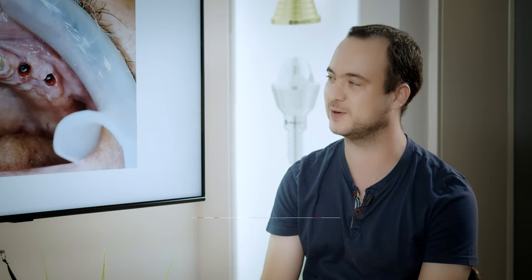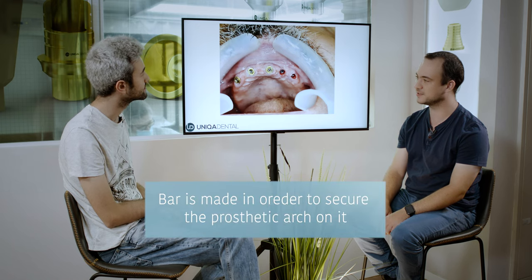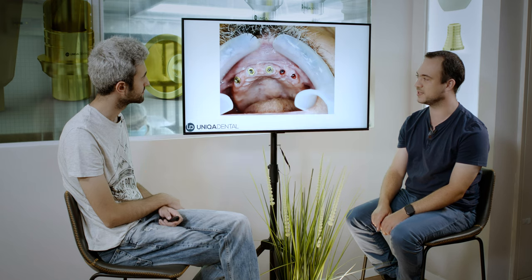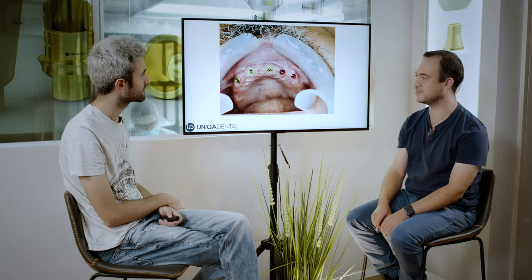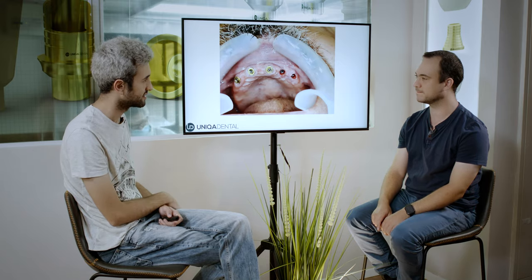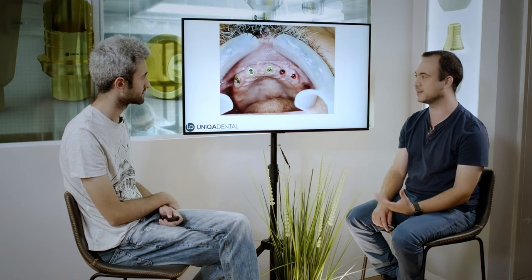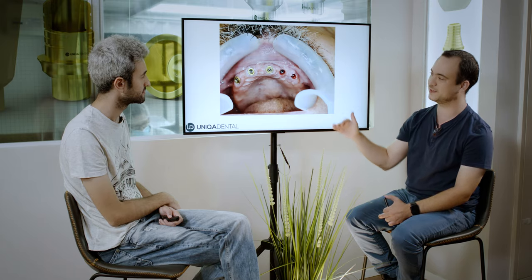What we're going to see here today is the Overdenture bar. The bar is based on five implants in the anterior region. On the implants you can see multi-units, and on the multi-units there will be the metal structure. All the implants are buccally inclined — that is one of the problems in this case. Because they're buccally inclined, we want the bar to shift into the palatal region so we'll get better aesthetics.